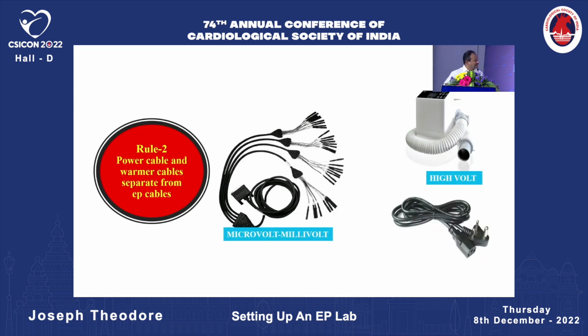Next slide. So rule number 2, again, power cables and warmer cables should be separate from the EP cables, because whatever signals you get from the EP system would be a microvolt or a millivolt. But whatever you use from a high voltage, either your warmers or even your power cable, will be at high voltage, which can interfere with signal interpretation.